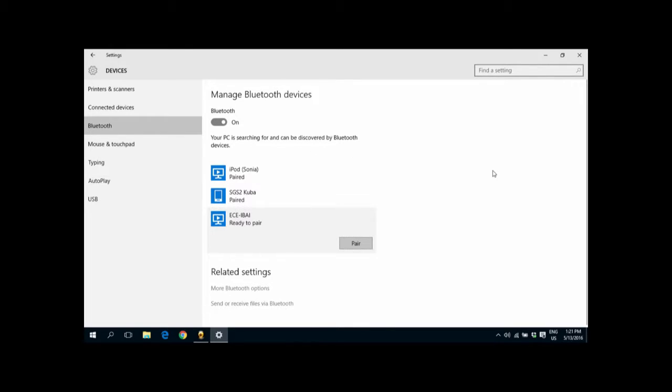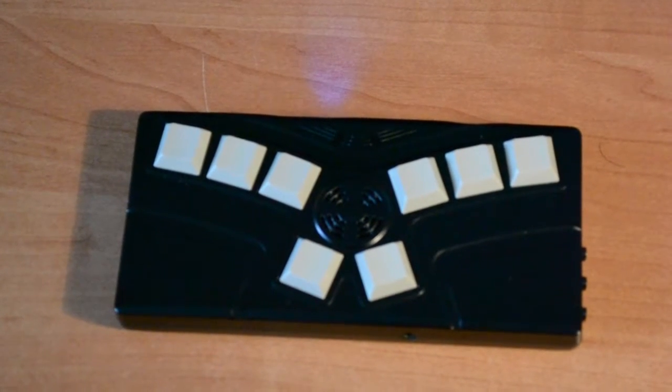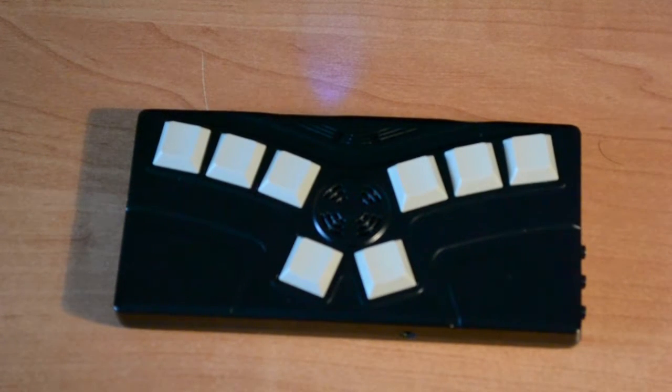Okay, it's switched on and it's looking for Bluetooth devices. It has found the IBAI, so we go to this device and we start the connection. The pairing process is on the way, so the IBAI is talking to the computer and the computer is talking to the IBAI to get the connection ready. Select the default connection mode. Okay, the authorization process is already done, but we have to select the connection type.